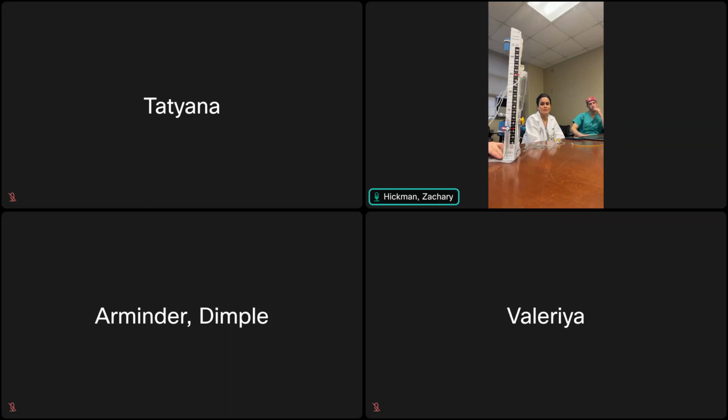So you can't raise it up and see the CSF going backwards. But back in the day before we had that, one way to test it was what's called tidaling, where you drop it down, you should see the CSF flowing forwards, and then you put it up and the CSF would flow back. But that filter will prevent it from flowing back. You can still see it flow back if it's not beyond the filter though. And then, say it's still not flowing, then I'll look to see if there's some obvious reason. Is there a big air bubble that's maybe airlocking it, or a piece of tissue or blood clot somewhere that's obvious? But then kind of go from there.